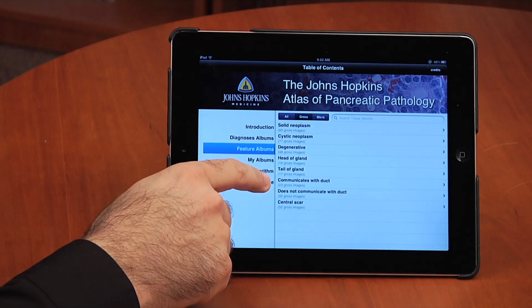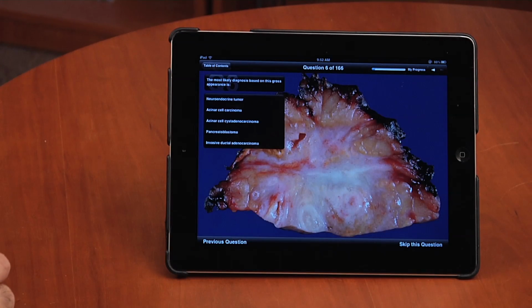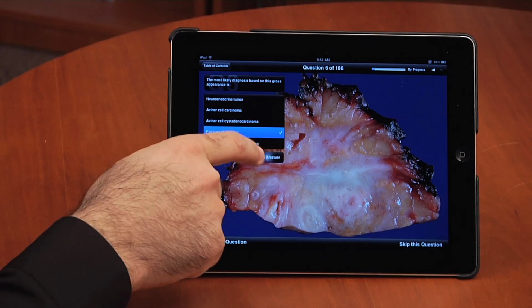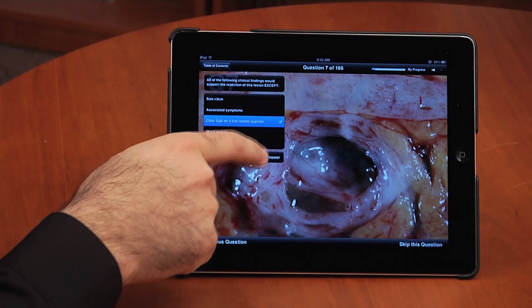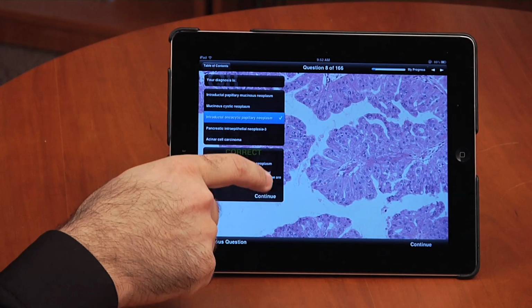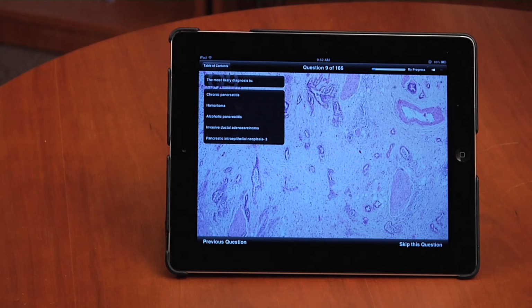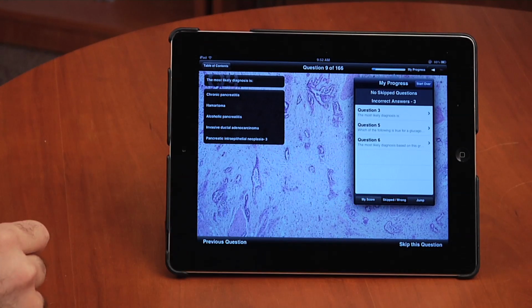We'll end with the Quiz Me module. Here we can quiz ourselves, our friends, loads of fun on a Saturday night. You can monitor your progress, see which cases you got wrong, and thank goodness, start over.